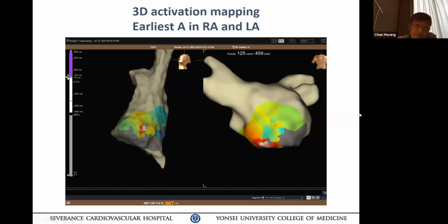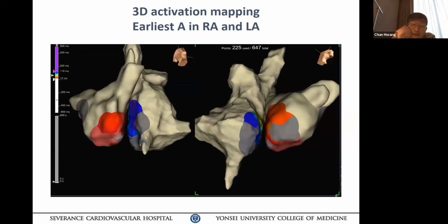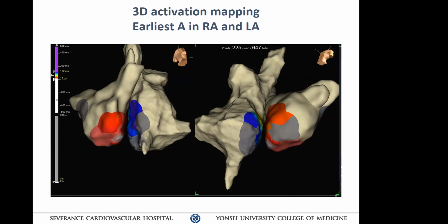So would give you a better idea where to map it. 두 쪽을 다 했어야지. left side도 더 extension하고 right side extension에서 올라가서 어디까지 올라가나 보고 breakthrough를 보면서 그 레벨에서 매핑해서 path의 potential을 찾아야지. 그래서 epicardial 케이스 같은 경우는 almost 10mm away from annulus a lot of time. 특히 ligament of Marshall inserting AP 같은 경우는. Okay? 이 환자가 always insert in the annulus.